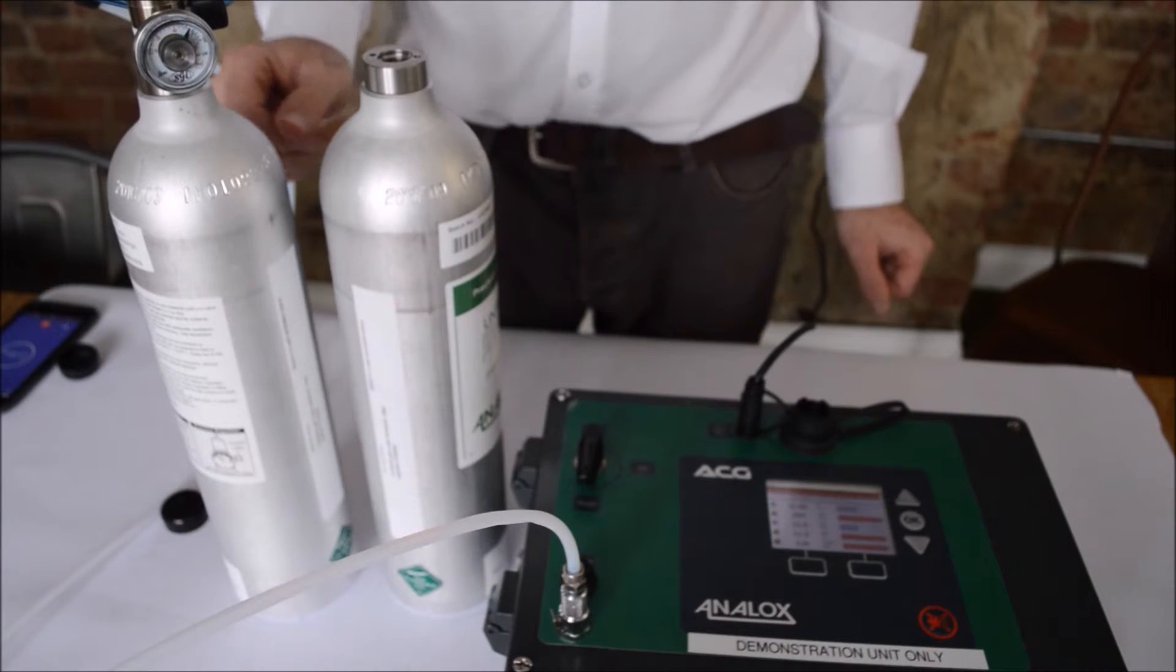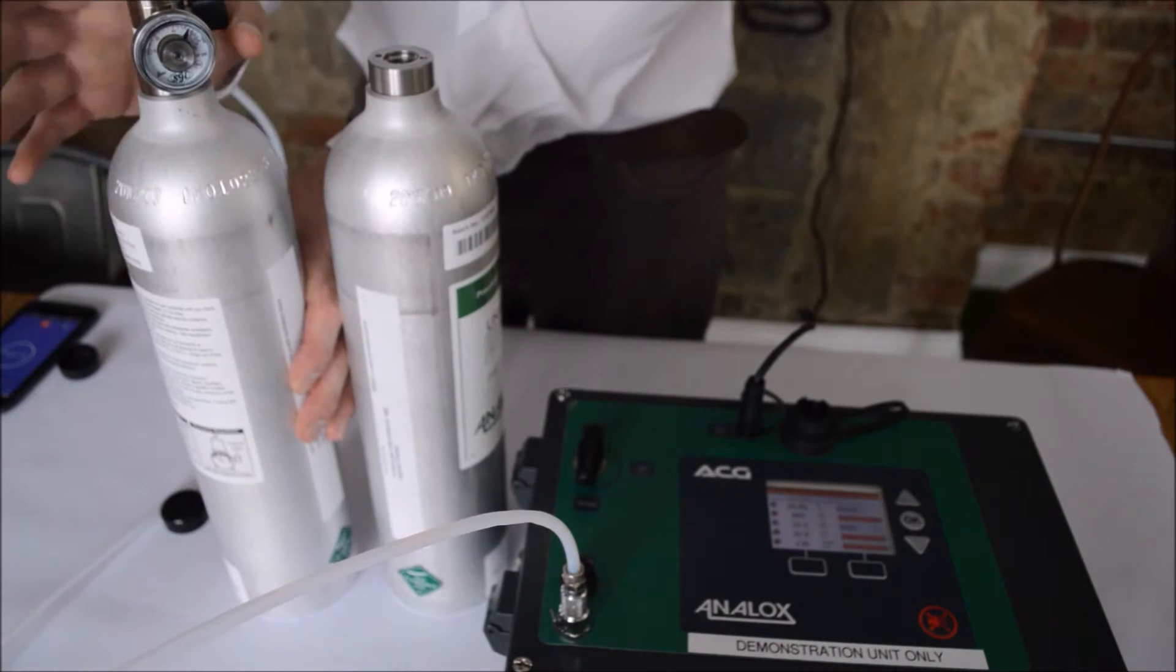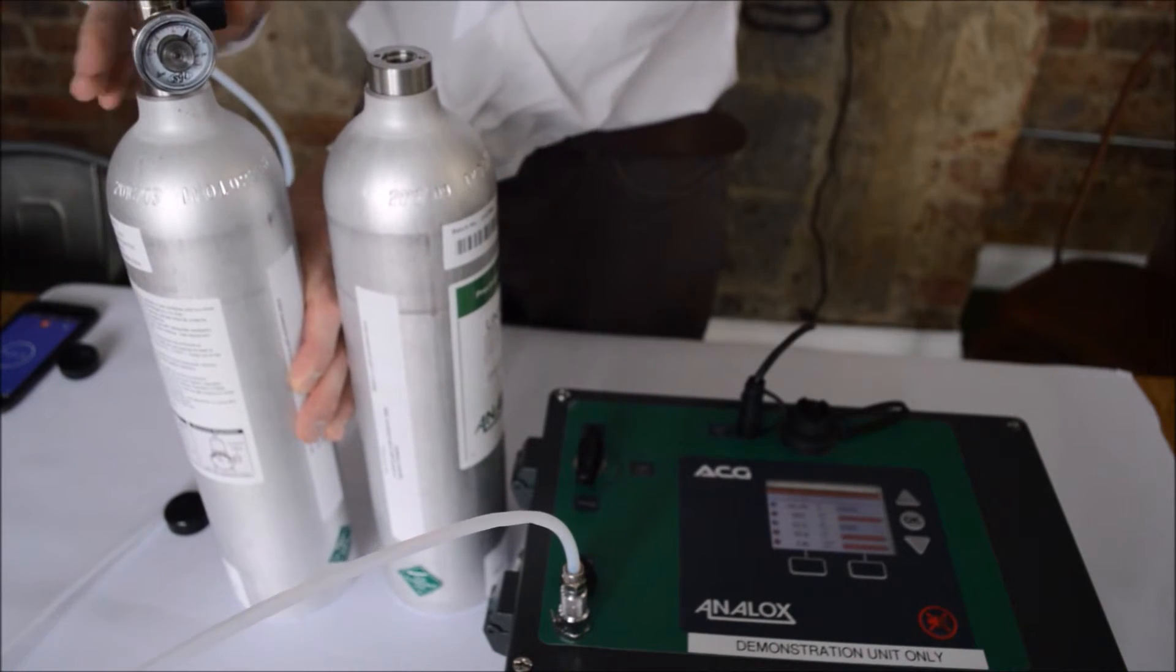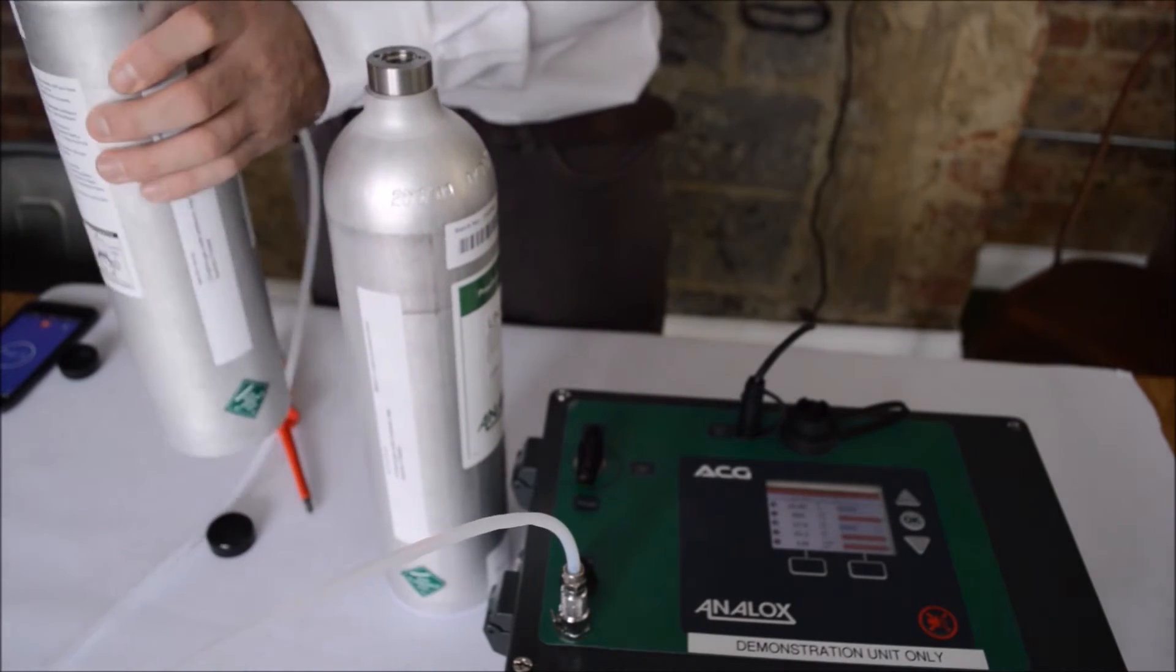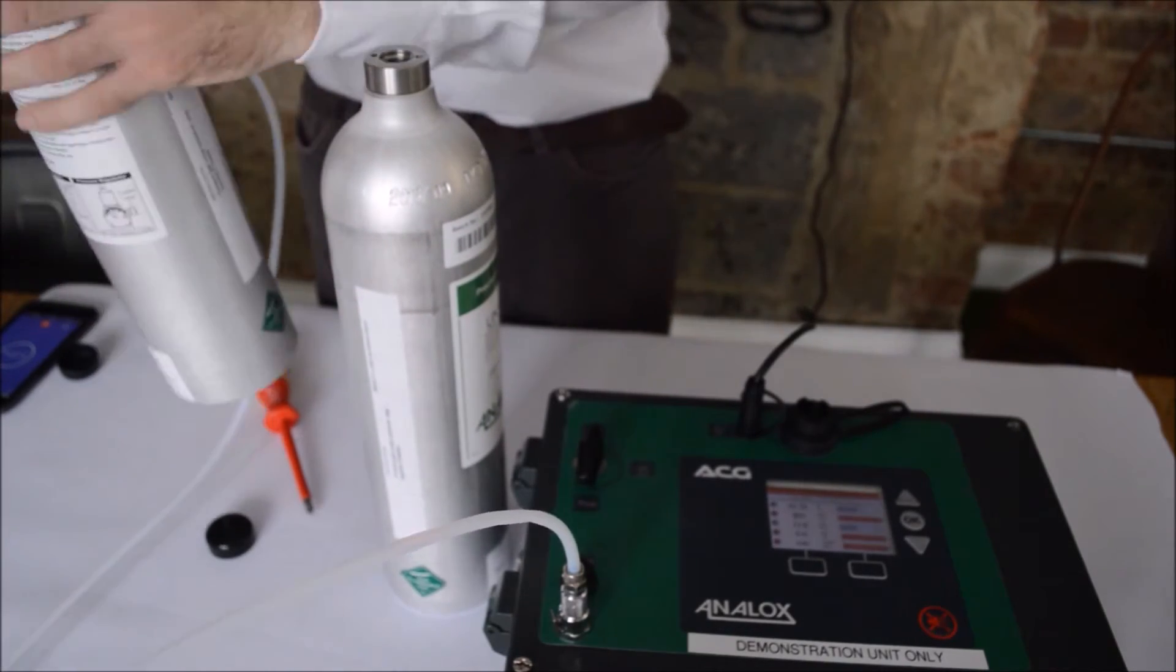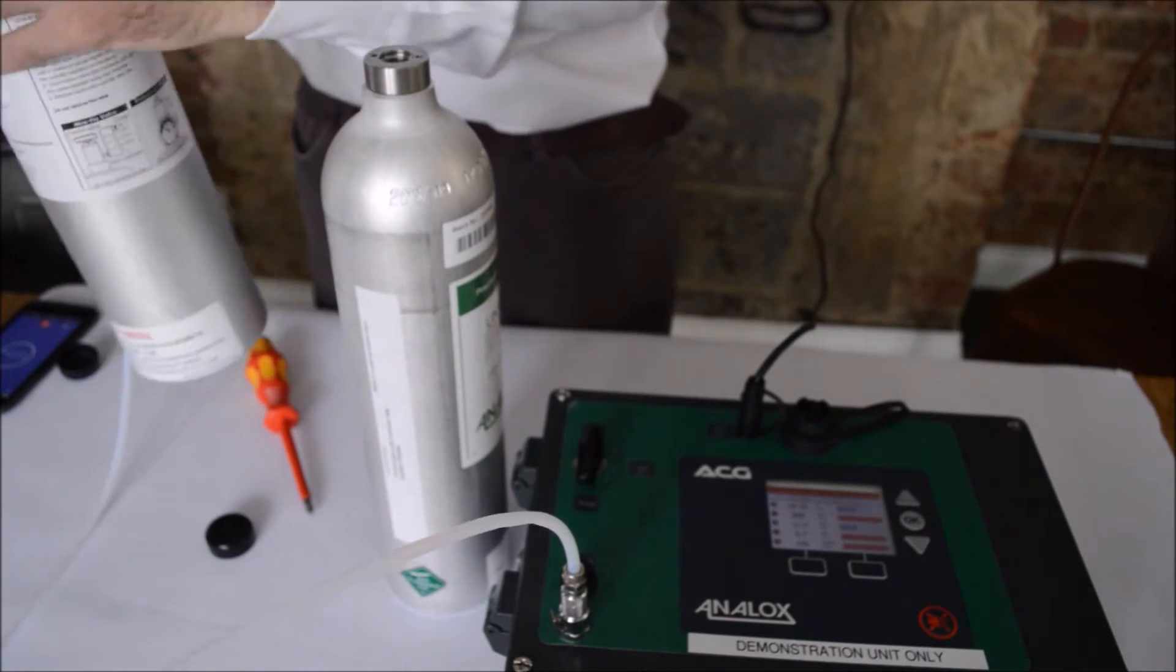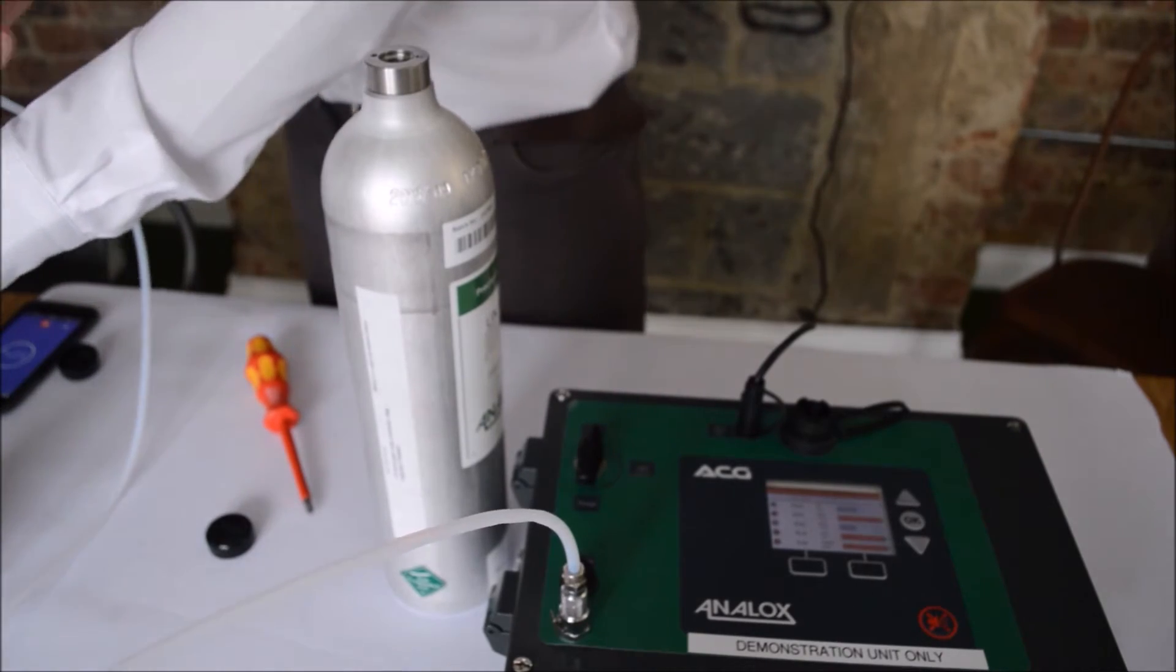We're currently connected up to a zero gas calibration, and what we need to do now is swap the calibration regulator from the zero gas to the span gas. So initially we turn the gas off, unscrew it anti-clockwise, and remove the zero gas.